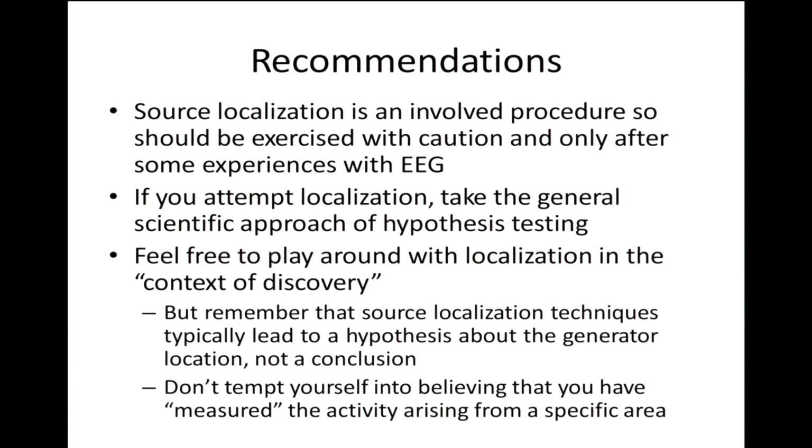But that also means, if you treat it as a black box approach, then you are more likely to end up with an inaccurate approximation, because you need to know exactly what you are doing. So it's quite an involved procedure, so it should be exercised with caution, and only once you feel more confident with EEG. So I don't recommend you go immediately to source reconstruction once you have EEG data.